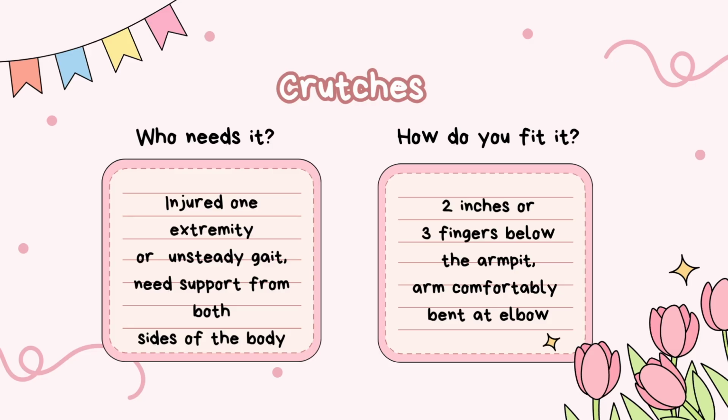Who needs to use crutches? Crutches are used for patients that have injured one extremity or they have an unsteady gait and they need support from both sides of their body.